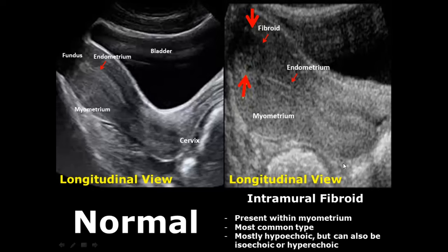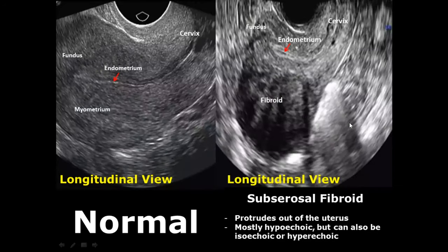Uterine fibroids, also known as leiomyomas, are benign tumors of the uterus divided into different types based on their location. The most common type is the intramural fibroid, present within the myometrium — it mostly appears hypoechoic but can also be isoechoic or hyperechoic. The subserosal fibroid protrudes out of the uterus and also gives a hypoechoic appearance most of the time.